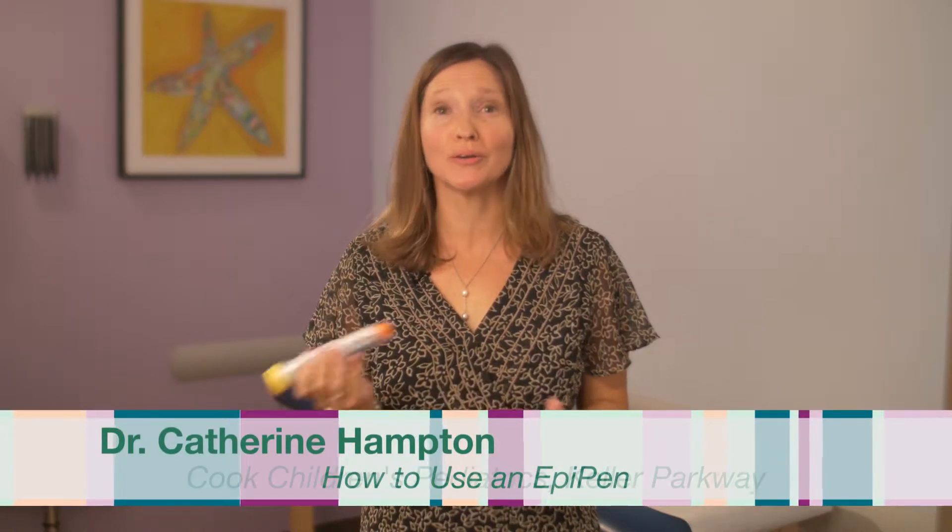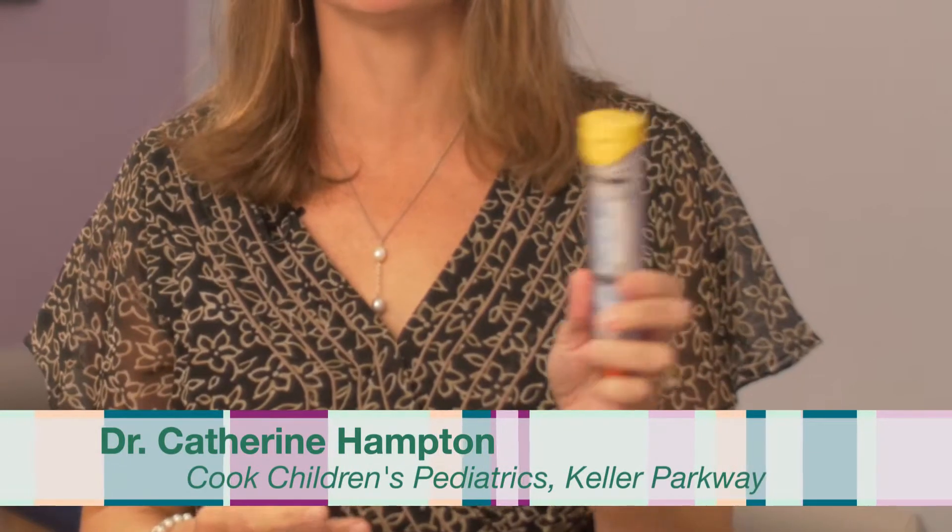Hi, my name is Dr. Hampton and I want to demonstrate today how an EpiPen works. This is an EpiPen. It is used for a life-threatening anaphylaxis emergency. It is not to be a play toy — it's to be used for an emergency. So let's go over how it works.